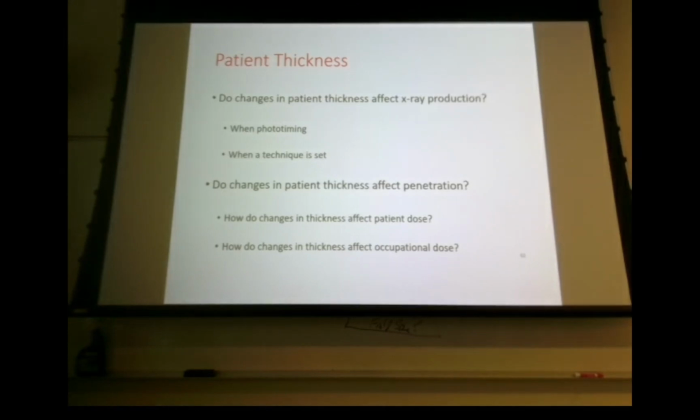And occupational dose: you're doing a fluoro exam on an asthenic patient. How much scatter do they create? Not much. Do one on a hypersthenic patient: a lot. It's going to be a lot more, right? So your occupational dose is going to increase. So what do you do? Stand back, get behind your lead, behind somebody where you're protected. Exactly.